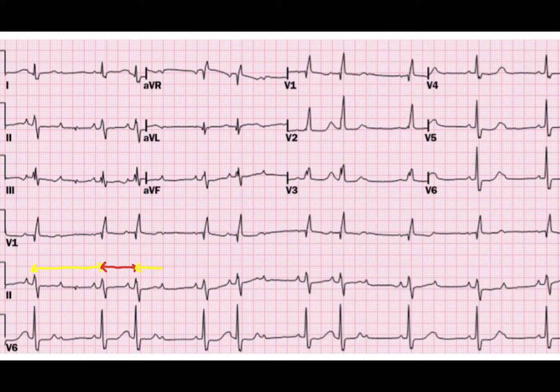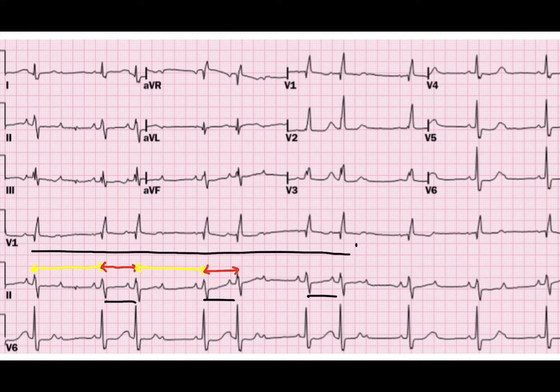The QRS complexes are irregular — not irregularly irregular, but regularly irregular. There is a sense of group beating here. And what about this part here? So you can see there is more to return to in this ECG.